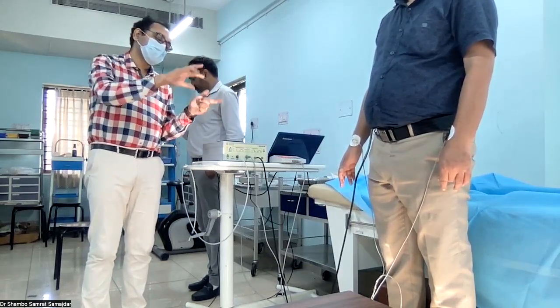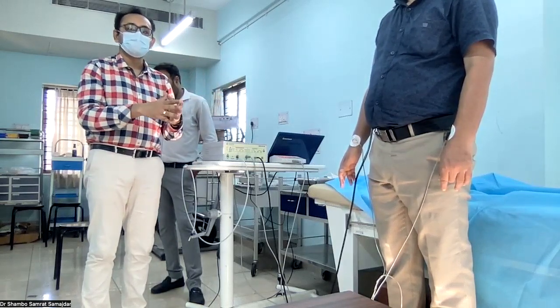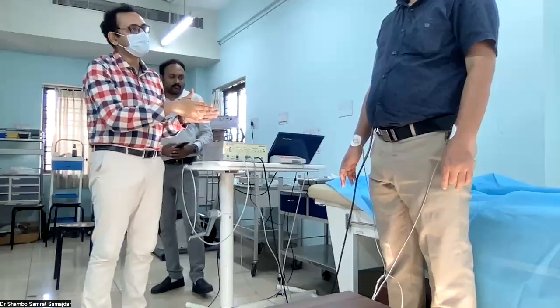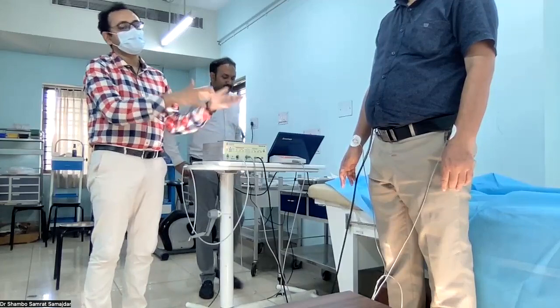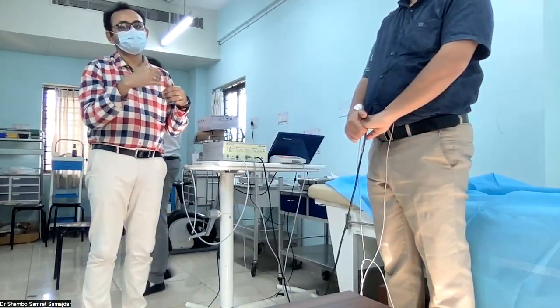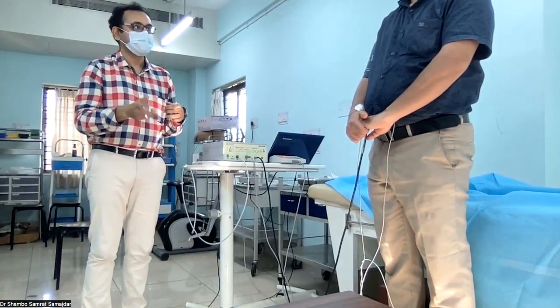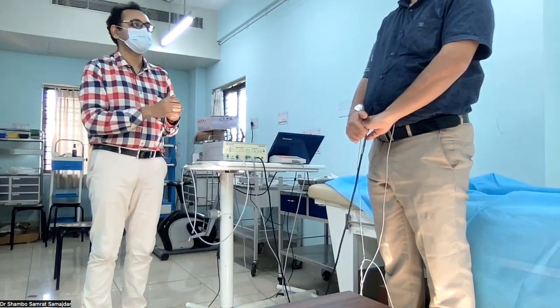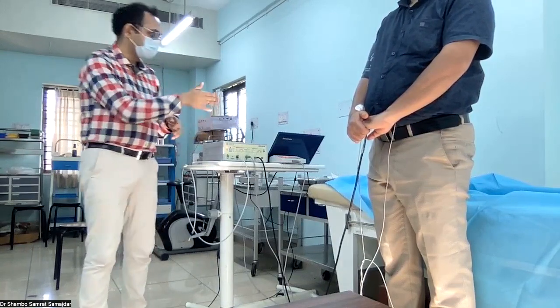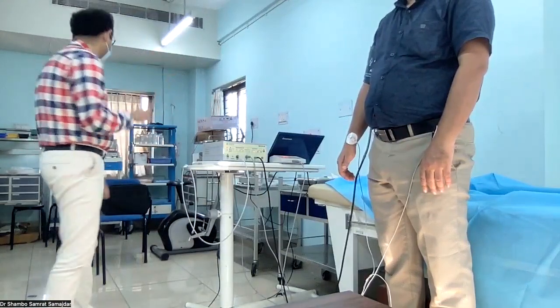Okay, so for all practical purposes here, we need to depend on the orthostatic hypotension cutoffs: lying down blood pressure, and then 3 minutes after standing, we check the blood pressure again to see the blood pressure drop, and then we can comment on whether orthostatic hypotension is there or not. So now again, your blood pressure is going to start. This is post 1 minute.